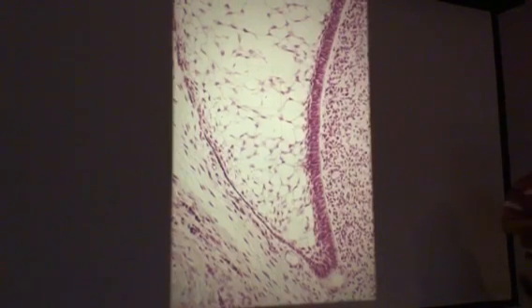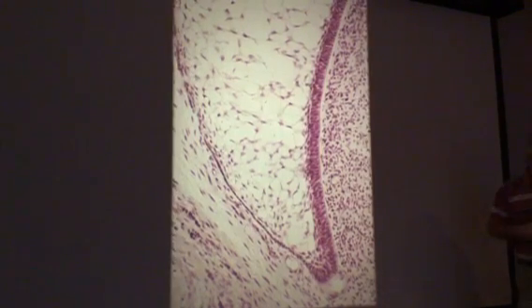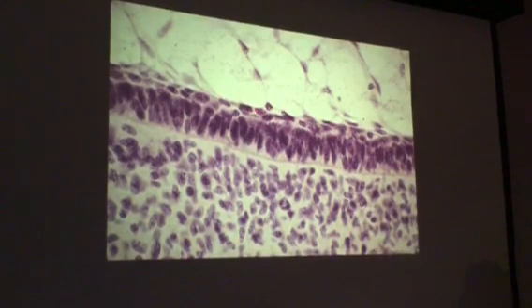You see the cell-free zone, but if we were to look at this and consider this on the basis of the ameloblast life cycle, which stage would these be in? Morphogenic stage. We don't see any odontoblasts being formed. So, therefore, we will call that the morphogenic stage. Same thing right here. You don't see any odontoblasts. You see the stratum intermedium.